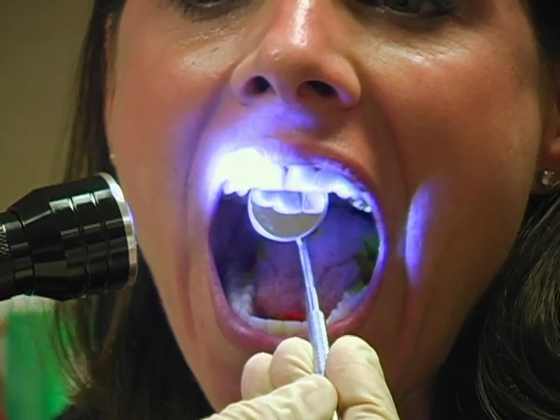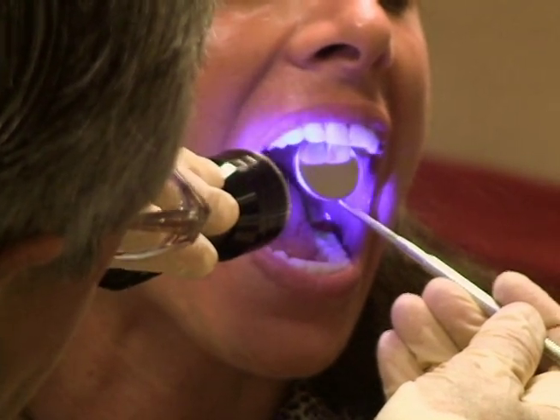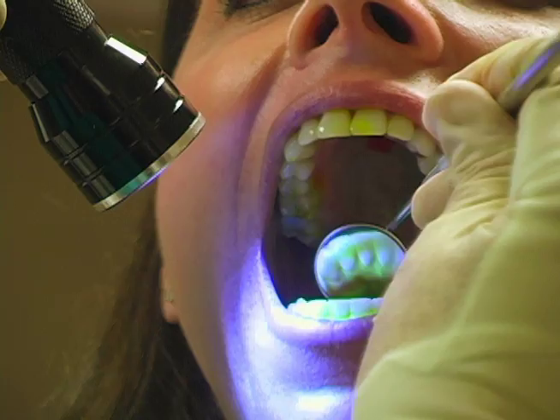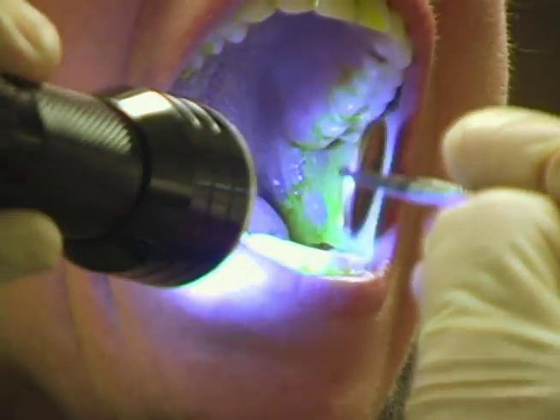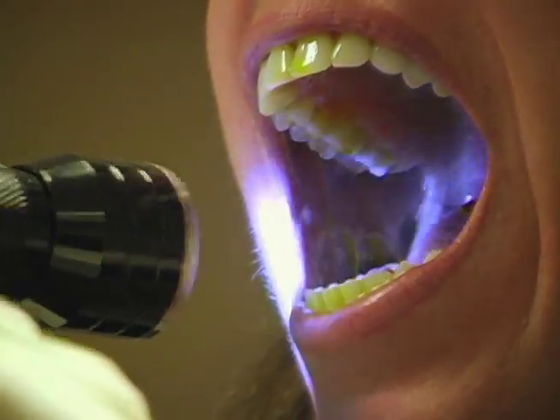Can you see the dye in the mirror on her upper front teeth? It lights up green. You can see all of that green dye, how heavy it is — coming out to her cheeks. You can see the dye all the way out to her cheeks, and not so much on this side.